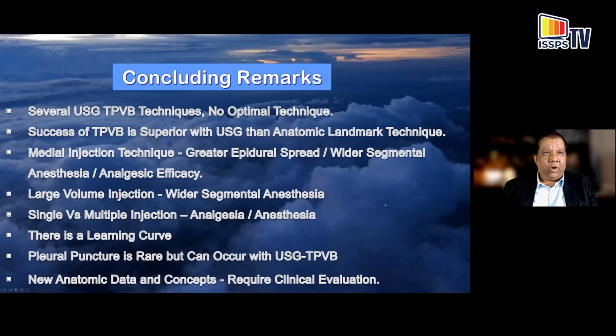So after this long presentation, I'm going to now conclude by saying that today there are different techniques for paravertebral injection. However, there are no optimal techniques described. Success seems to be superior with ultrasound guidance than with anatomical landmark techniques. So this is one reason why you should take up paravertebral blocks with ultrasound guidance, of course, after proper training in these procedures.